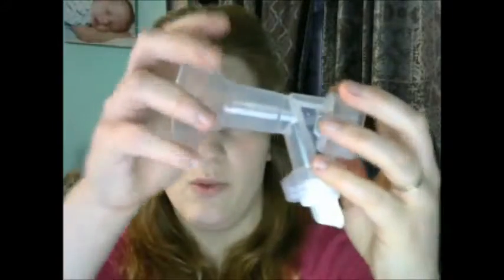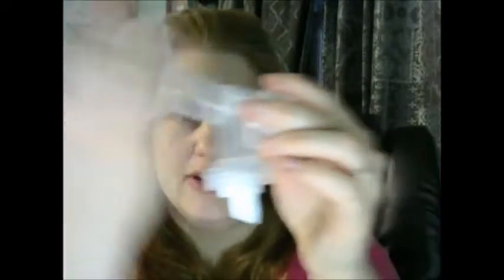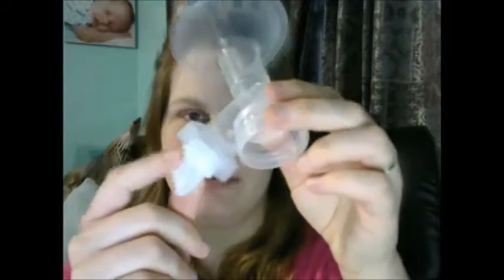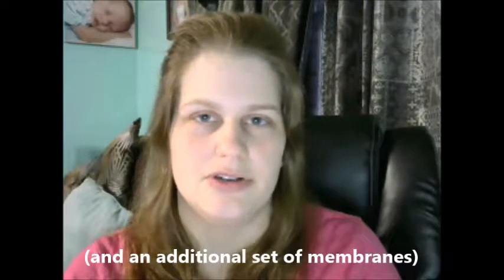So that's what I get with Medela. When I ordered through Pumpables, I get a one-piece, so there are fewer pieces to lose, forget, or misplace — a one-piece flange. It also has the same style membrane and valve, and it also comes with a backflow protector, which maybe some other pumps use.